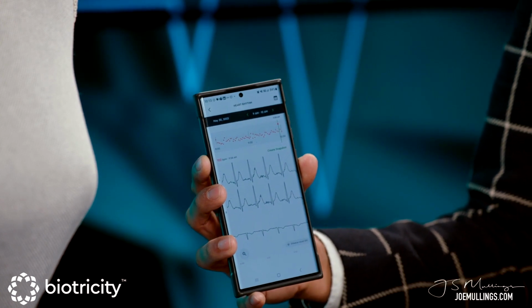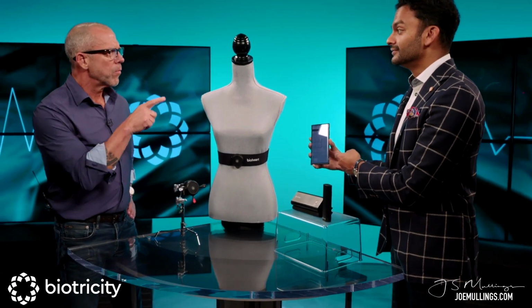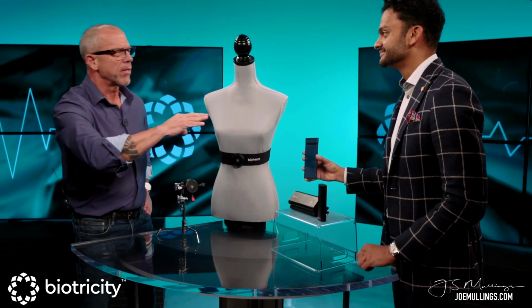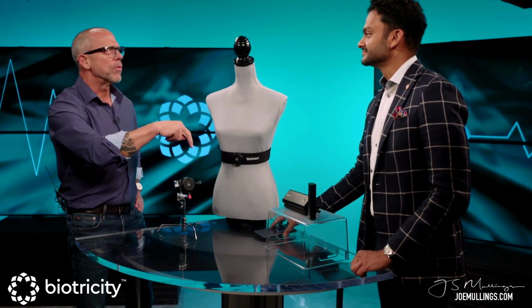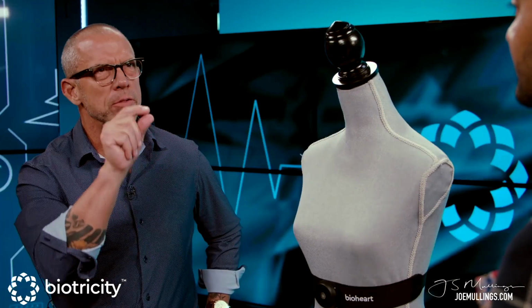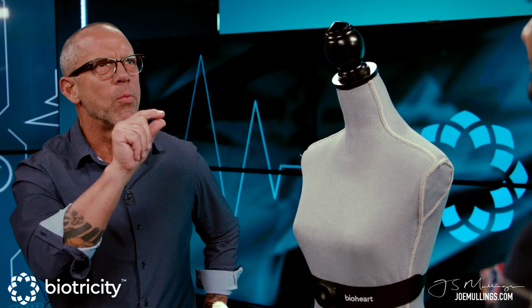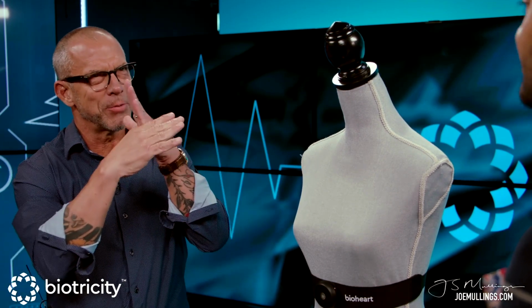And I can go historically, right, as an individual. And if, let's say it's still weird and I don't know, I can create a bookmark here, and I can send it to my physician instantly right now. And what if I worked with, well, you're an Android there, so you're an outlier. But what if I worked directly with an Apple or Android, and said, at that time, I want you to geographically place me where I was and what was going on at that point in time. So now I could start to collaborate.